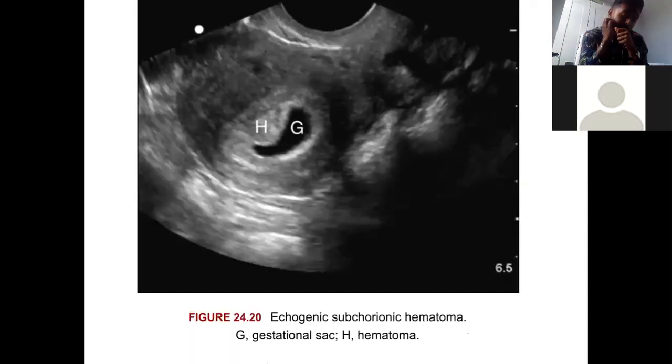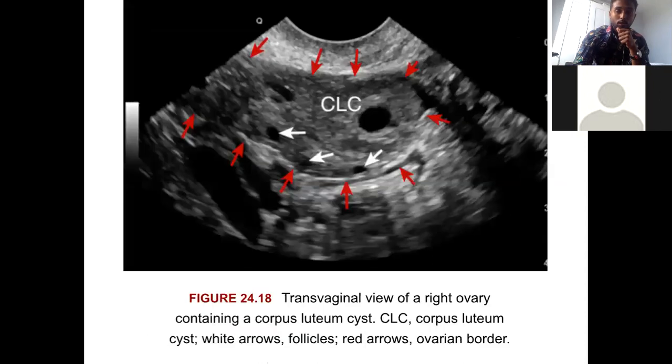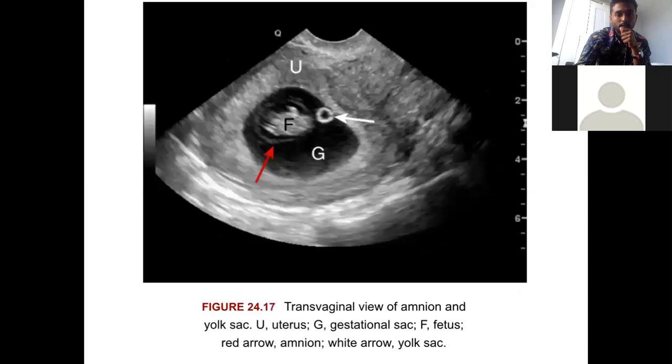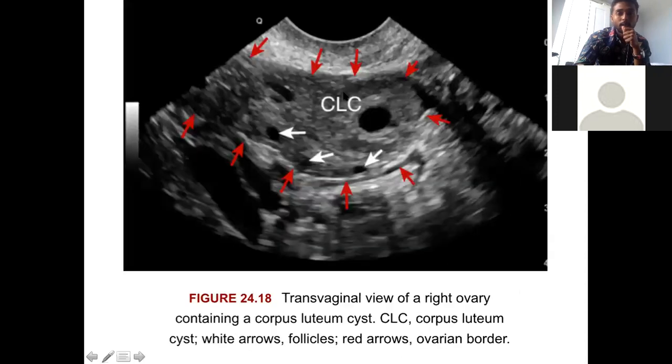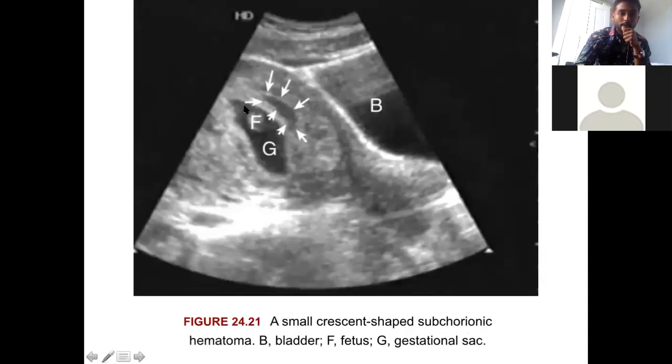This is ovaries. Okay. Abnormalities, like as you can see with the gestational sac, it's usually, as in all the pictures I've shown you, pretty circular or elliptical, right? So if the gestational sac looks all weird like this, this is a subchorionic hemorrhage. As you can see, this is the gestational sac and this is really hyperechoic beyond it. And you can be like, what if that's the chorionic membrane? But look how thick this is, and it's not really symmetrical. So the gestational sac is not normal. Let's look at the other one. You see how the chorionic membrane is pretty thin and symmetrical. But in this one, on this side, it's a lot wider. So this is a subchorionic hemorrhage.